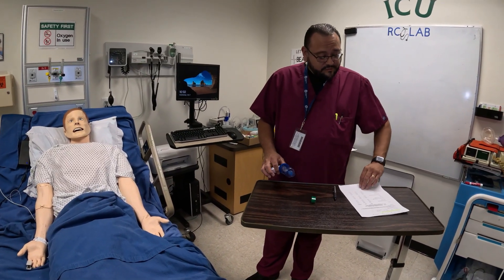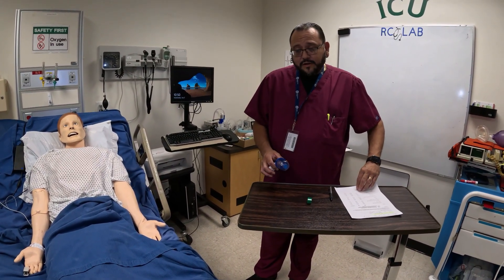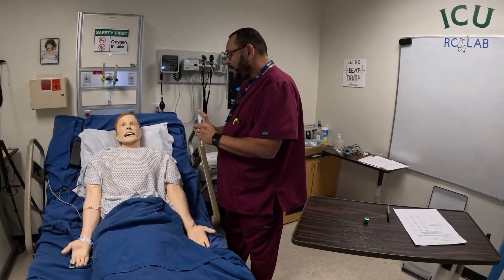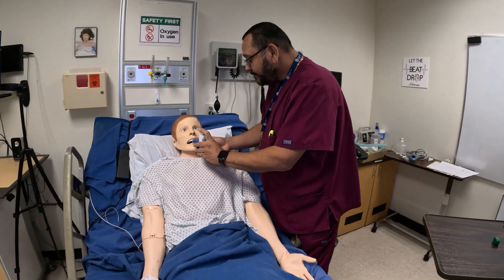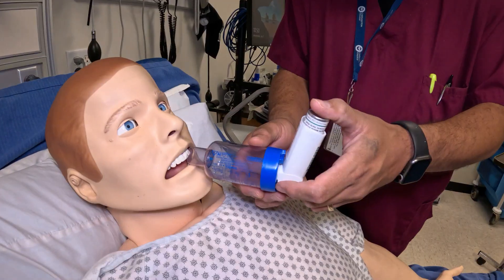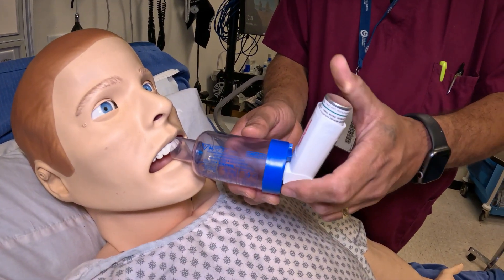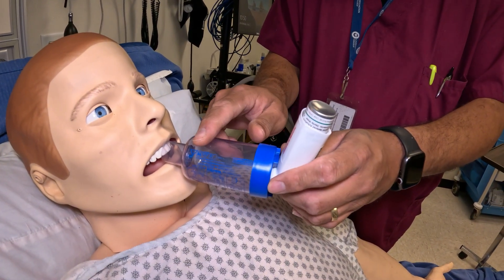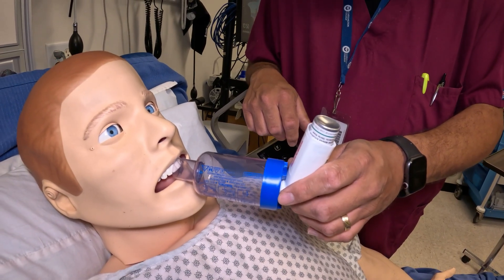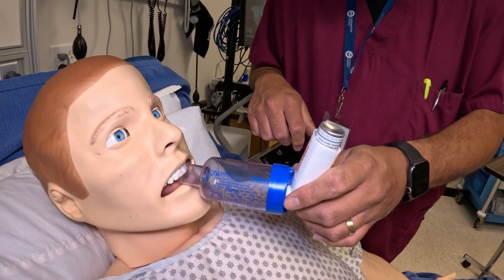We're going to do this first with the spacer, and then I'll talk about without it. Mr. Smith, I'm going to have you go ahead and put this in your mouth. We're going to push this down — the patient can do it or you can do it. The medication is going to go in here. I'm going to ask him to take a breath in and hold. So take a big breath in and hold.